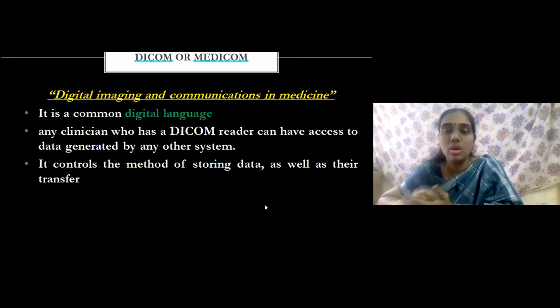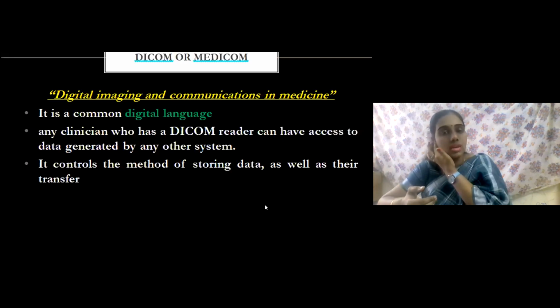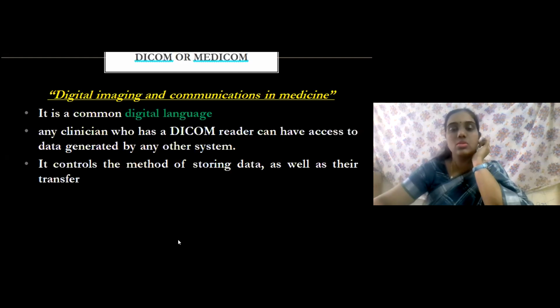So it is a software that reads all the 3D data. It also controls a method of storing, and it is helpful for transferring from one computer to the other, and it is also patient friendly. Even if the patient has 3D data, if he has a DICOM reader, he can receive the 3D data and store it. This is the language which is used by the computers to speak among themselves.